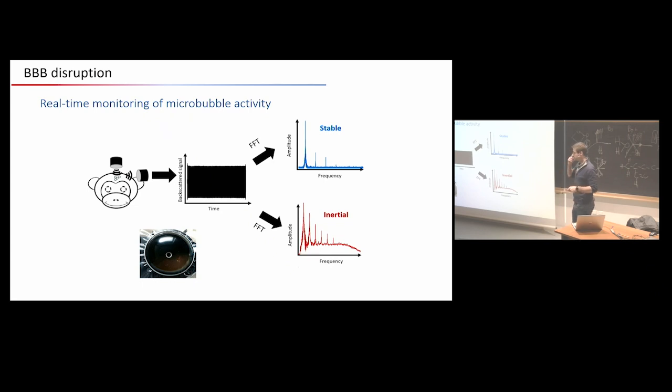Another way to control the cavitation of microbubbles during the therapy is real-time monitoring. So we are listening by putting different ultrasound transducers around the head. They're just listening to the signal from the microbubbles. They're not exciting. The therapeutic transducer is exciting, but those transducers are just listening.